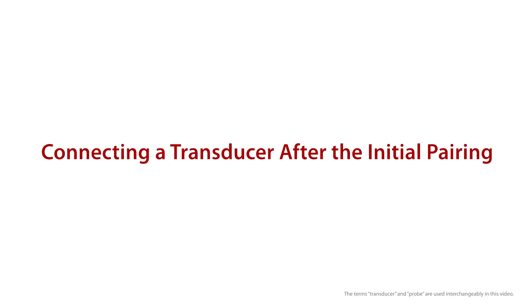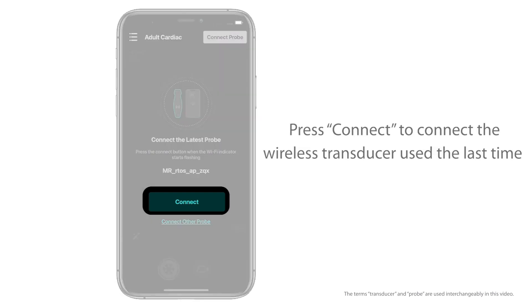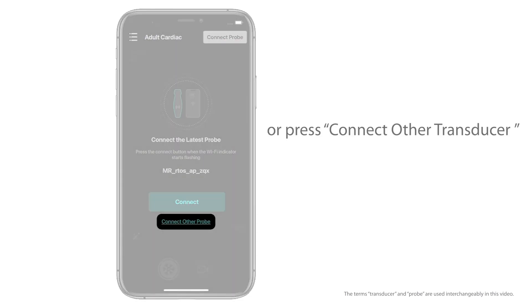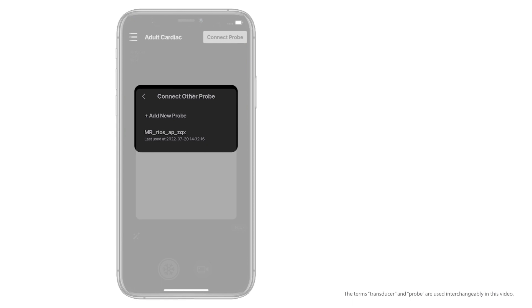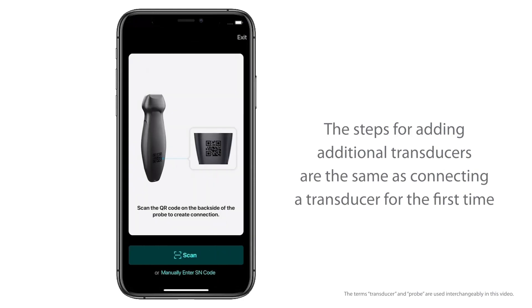Connecting a transducer after the initial pairing: After logging in, the Connect the Latest Transducer window will pop up. Press Connect to connect the wireless transducer used last time, or press Connect other transducer to add a new transducer or connect an existing transducer in the list. The steps for adding additional transducers are the same as connecting a transducer for the first time.